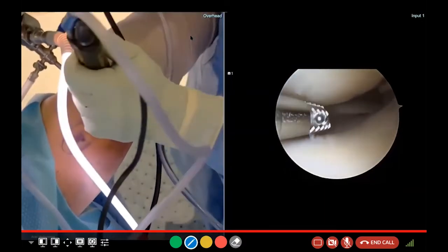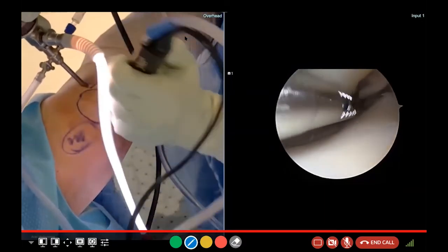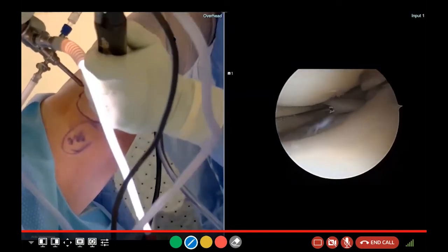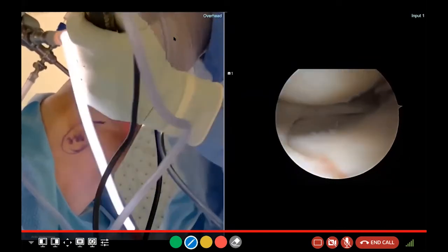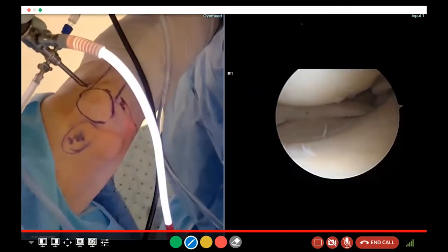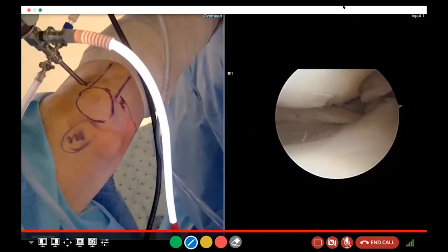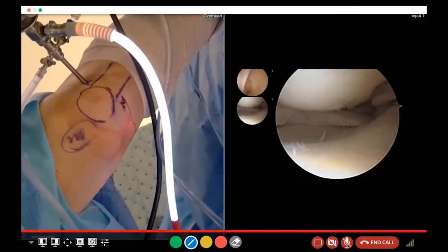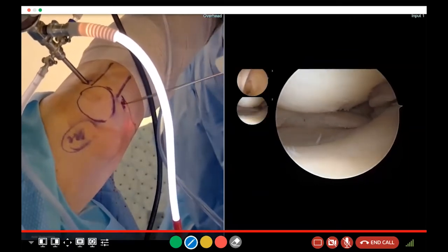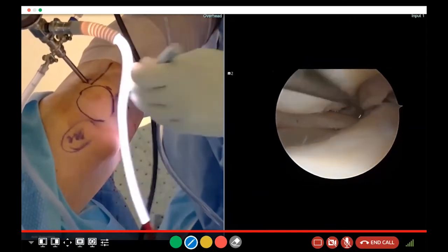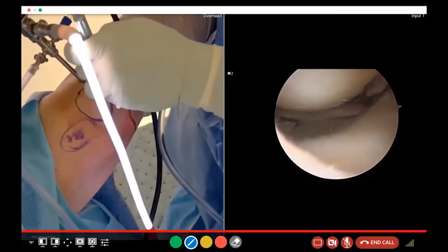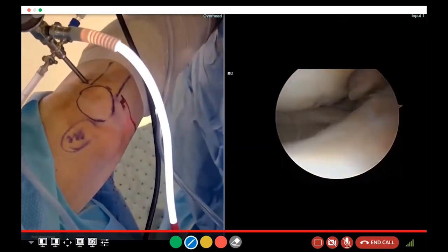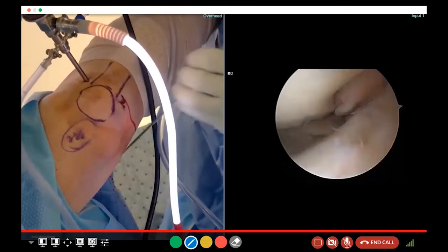Any softening of the cartilage or fraying — kind of looks like fur — we debride that. We call that mowing the grass. Let me see a probe. You can see where we are now versus where we started — pretty dramatic difference. I'm going to probe and make sure there are no loose pieces there. I'm actually pretty pleased with that.